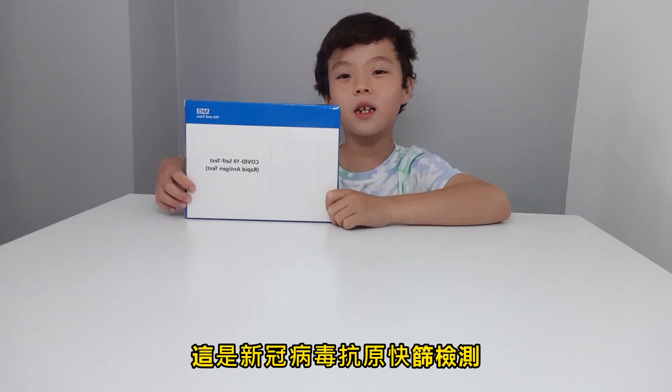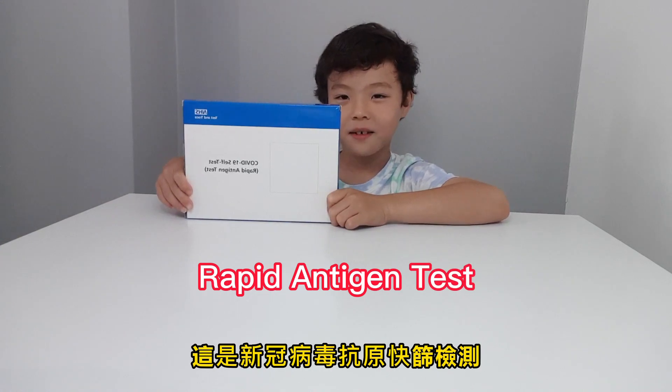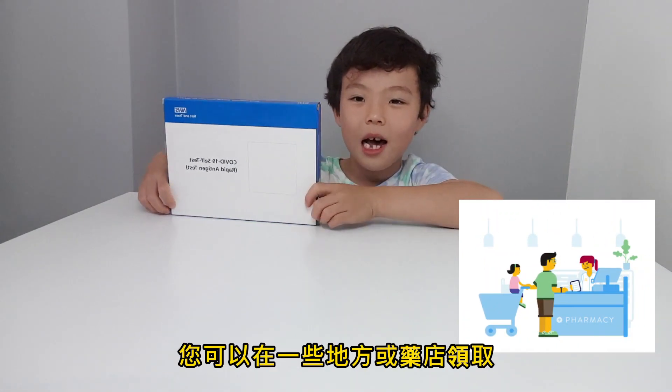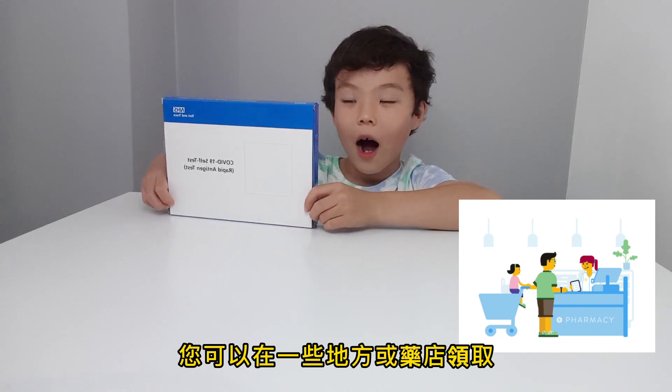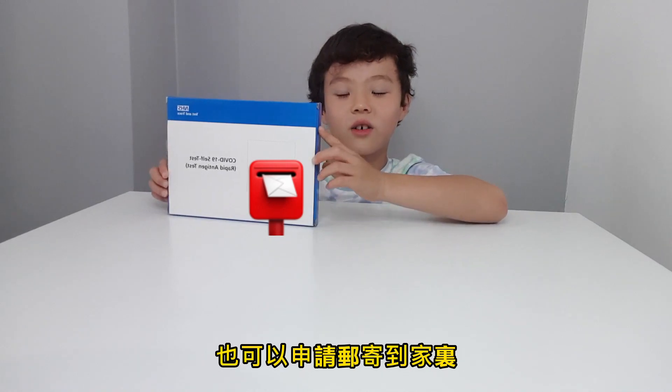This is a Covid-19 rapid antigen test. Now in the UK, you can pick this up from places or pharmacies. You can also request to post this to your home.